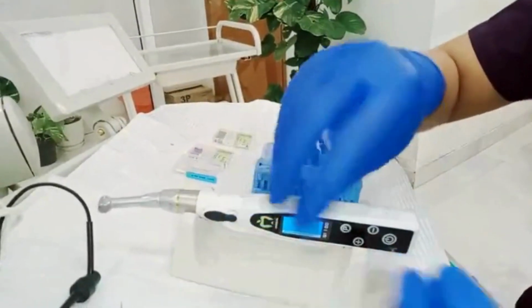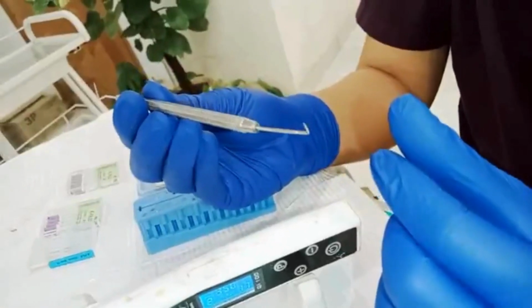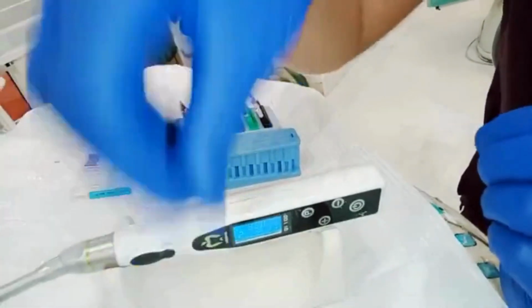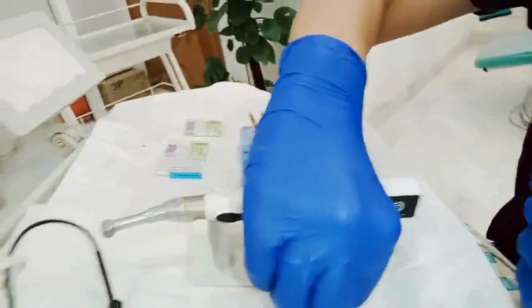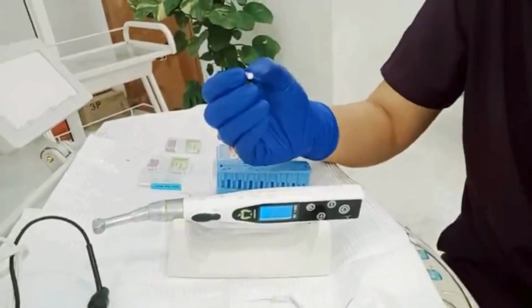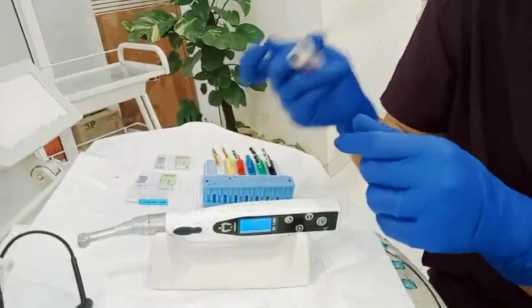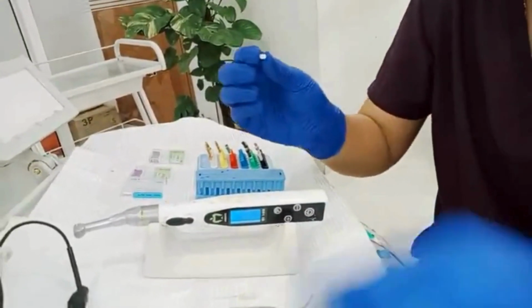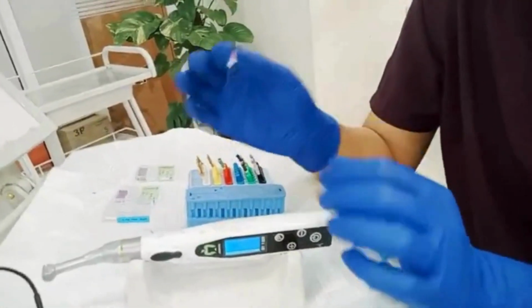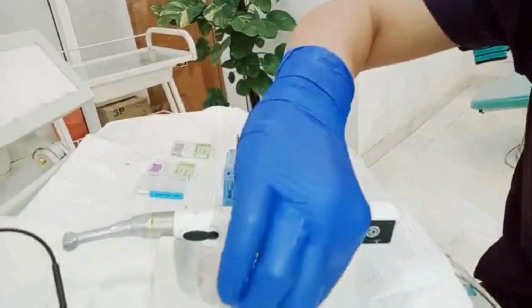When we have done our access opening, then we'll negotiate the canals with DG16. This is DG16. Then after negotiating canals with DG16, we use 10K number 5. What you have to do is take some EDTA. Either you can place it in the canal or you can place it here and put some EDTA over this 10K file and then put it inside the canal till it goes freely. Then you can stop it.